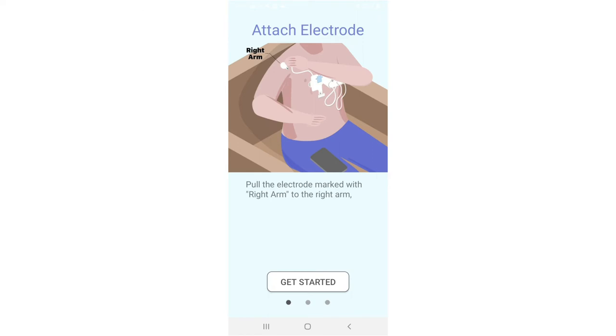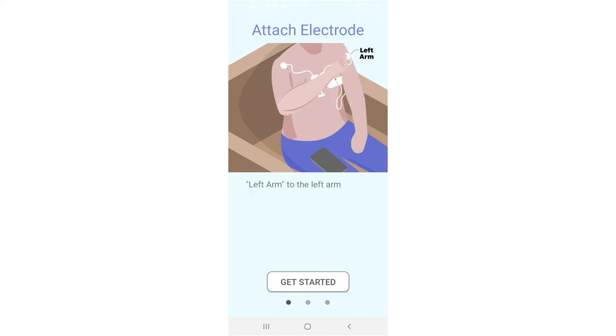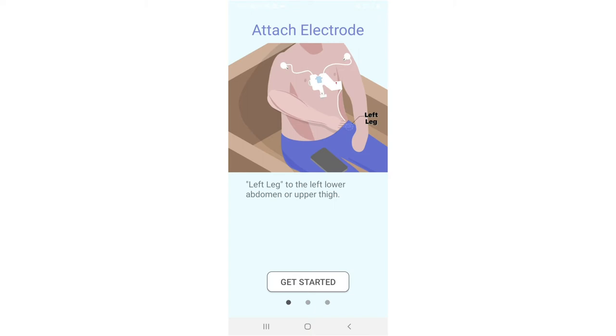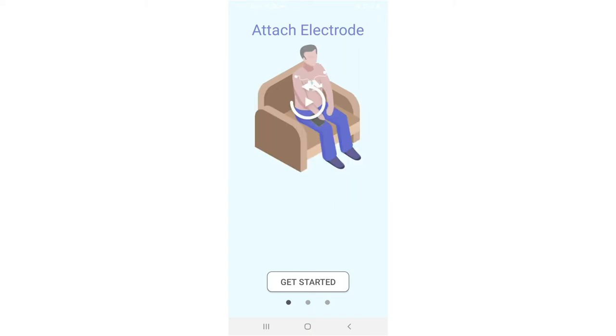Pull the electrode marked with right arm to the right arm, left arm to the left arm, and left leg to the left lower abdomen or upper thigh.